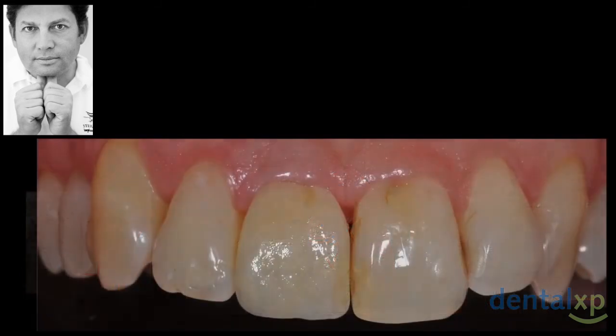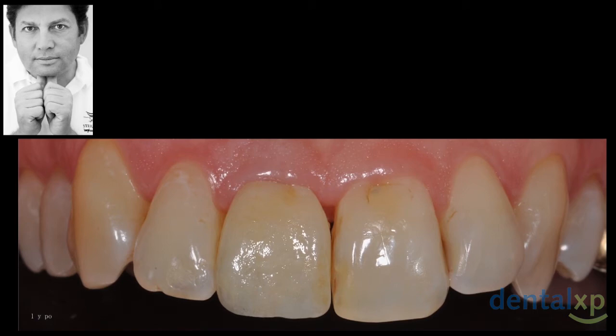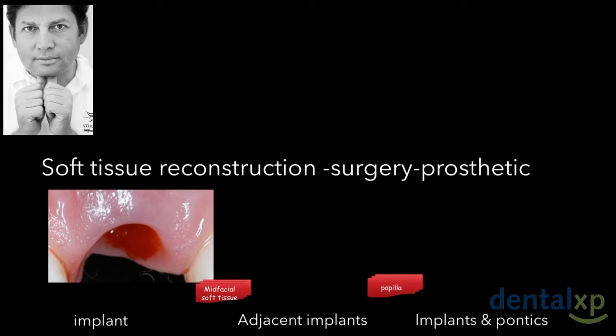Now let's see how we're moving now. So we look at the 1 year follow-up. You see this is the gingival contour, which we created in delayed implant placement. And when we look at the literature, we wanted to see, can we improve? Is it still 2.5 to 3 times more recession in these cases? And you see the implant has thicker soft tissue than the tooth. The emergence profile of the implant has nothing to do with the emergence profile of the analog natural tooth, because biologically, long-term, we need more. And when we look at the follow-up, this is the 1 year follow-up. Now I will show you up to 15 years follow-up.